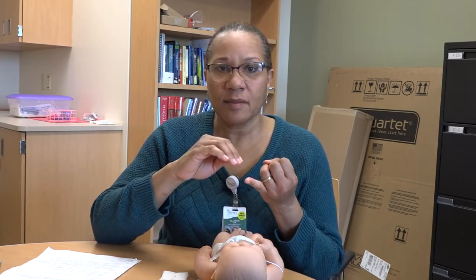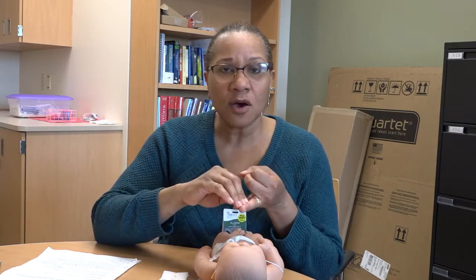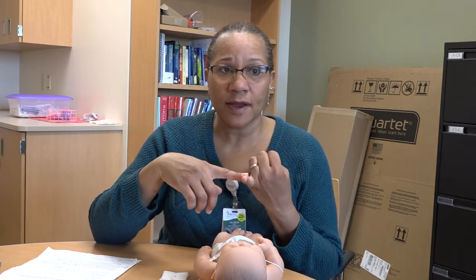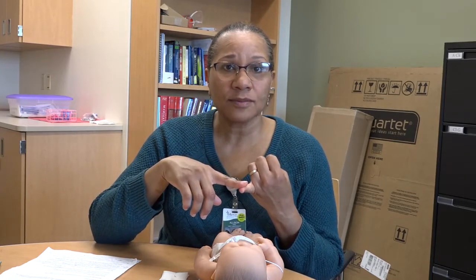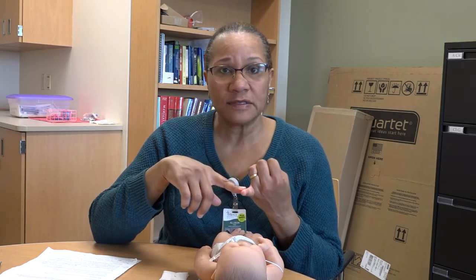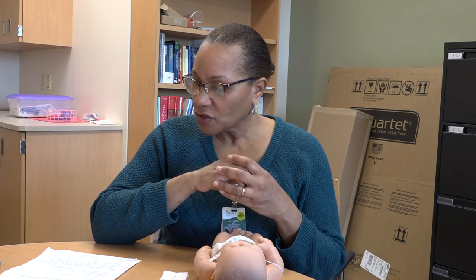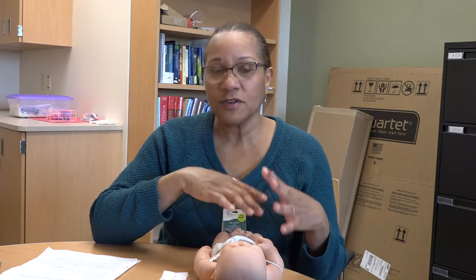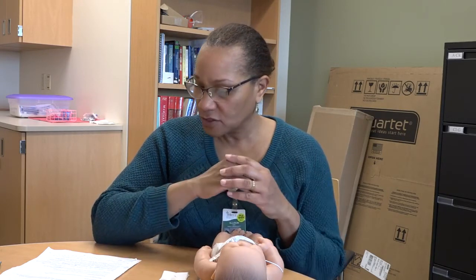If you notice any drainage that is green or thick yellow, or any bad odor at the site, those are all signs of infection. If you're noticing anything like that, we want you to call our office right away and let us know so that we can have you come in and be seen by Dr. Kumar. So that's the first thing: inspecting the skin around the site and making sure you're not noticing any of those signs of infection.